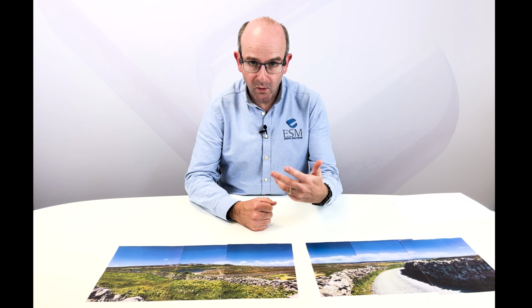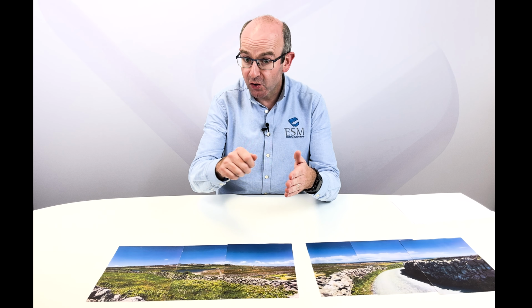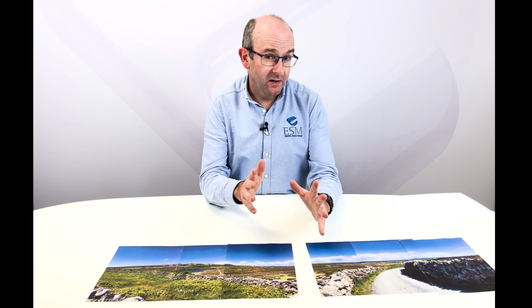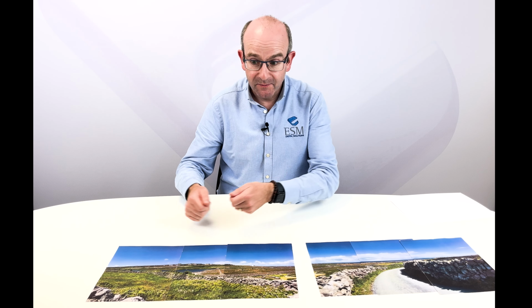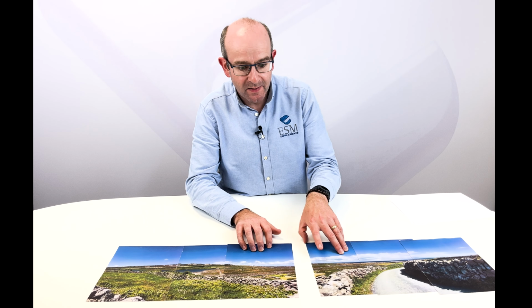So we also should always be patient, tune into the scanner, tune into the image being generated. If the image is being generated nice and fast and you're moving in a consistent manner, awesome, keep going. If the software starts slowing down a little bit, it's really giving you some feedback, giving you a message to say, I'm struggling here, go slow with those images. Imagine you were giving me 1,000 images every minute and I'm trying to align them. It's going to be near on impossible. Well, it is going to be impossible.